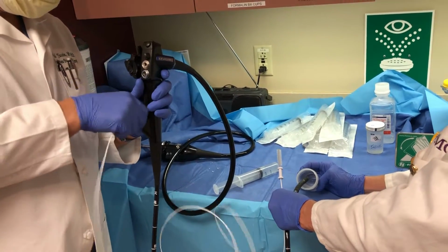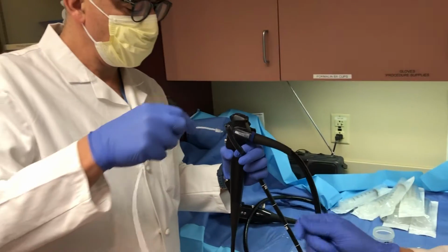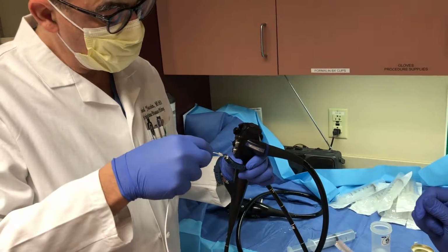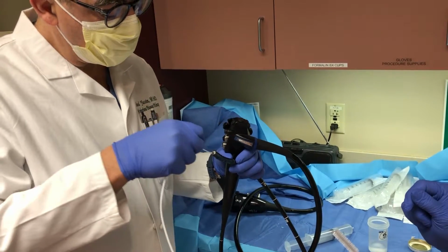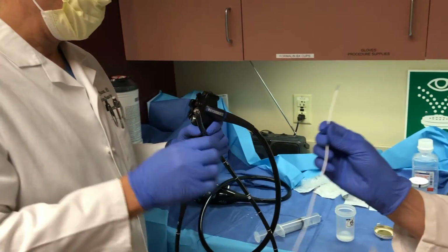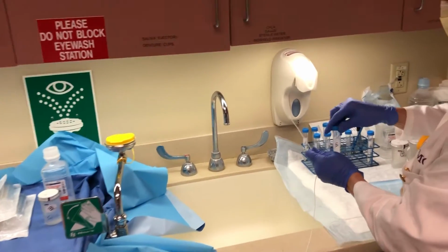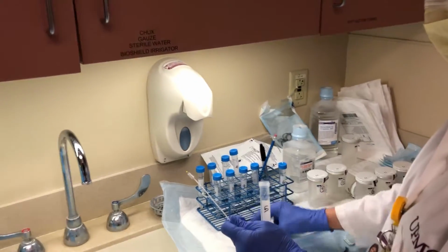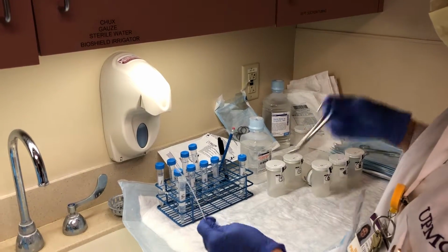And now Dr. Yassine is withdrawing the brush, keeping the scope tip sterile, giving an extra little scrub to that lumen. It's retrograde. And now I'm going to snip that tip off into the sterile saline.